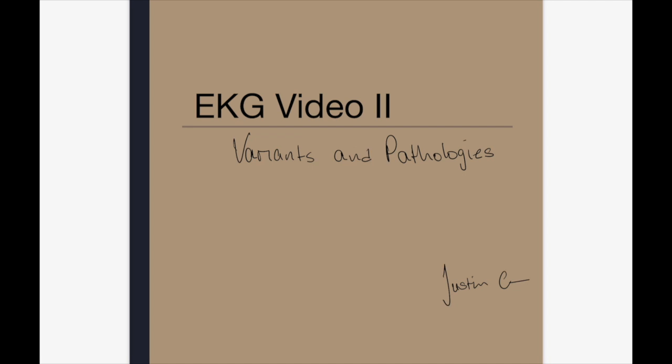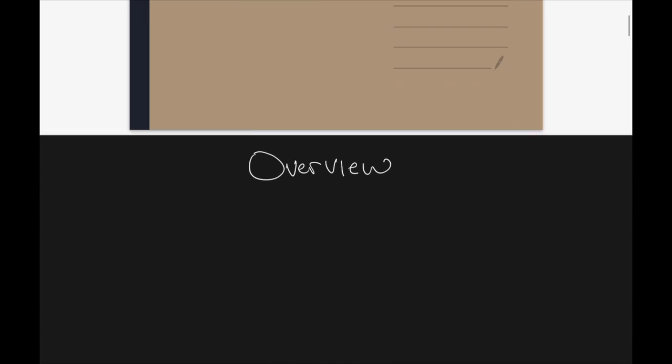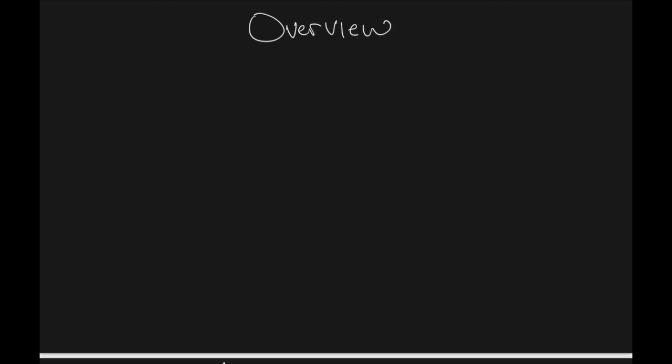In today's video, we are going to expand upon all that hard work we did in the first video, and we're going to look at when things don't quite look textbook. So we're going to start seeing when things can change a little bit, and when we should be concerned about that change. As an overview, this video has two parts.